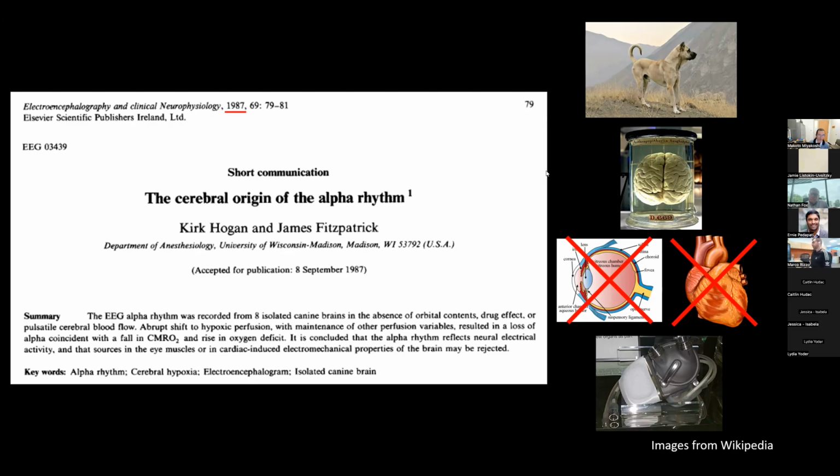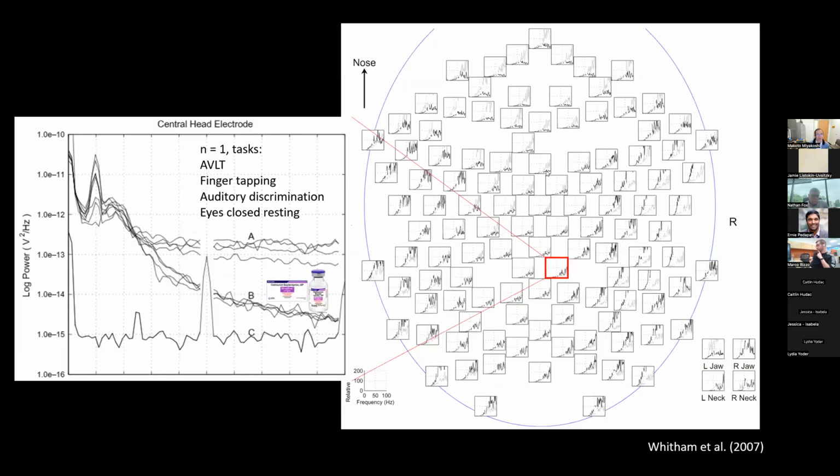And when they turn off the machine, then of course blood circulation stops. Then that makes the EEG level much lower. So this on and off of the heart is something Berger couldn't do in his time. But after making those experiments, we can finally say that yes, EEG signal is really from the brain. But as I said, it does not necessarily guarantee the optimism we may enjoy.